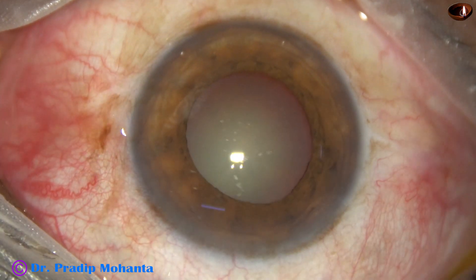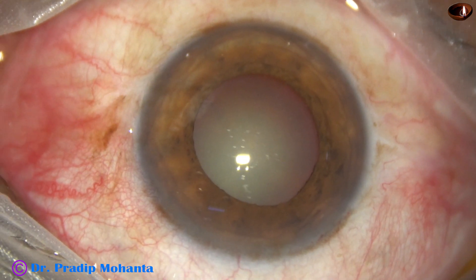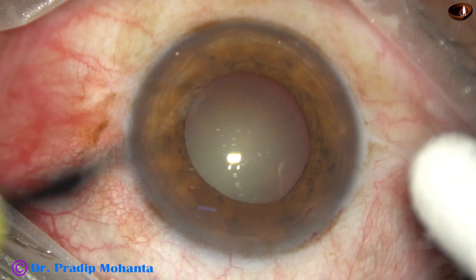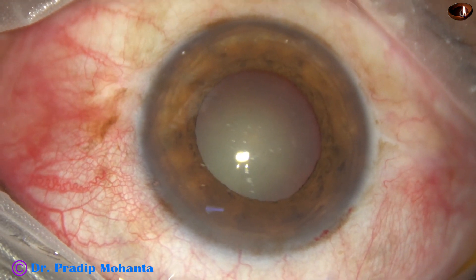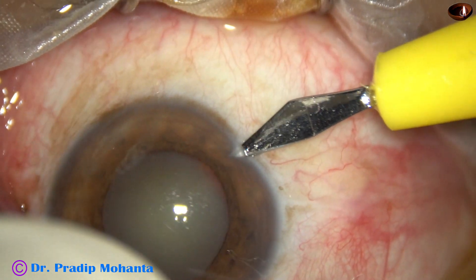This is the main incision with the 2.8 millimeter steel keratome. And now a side port is being made on the right side of the main incision.